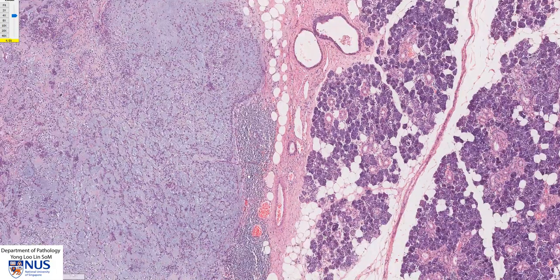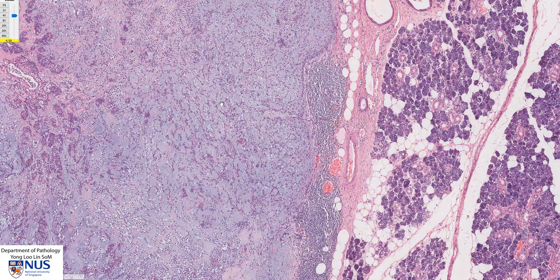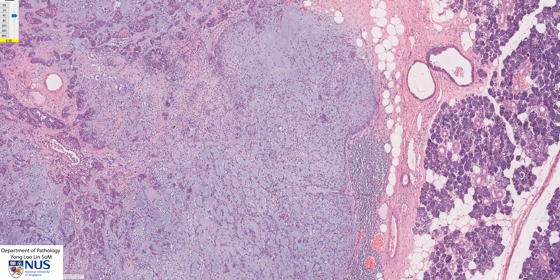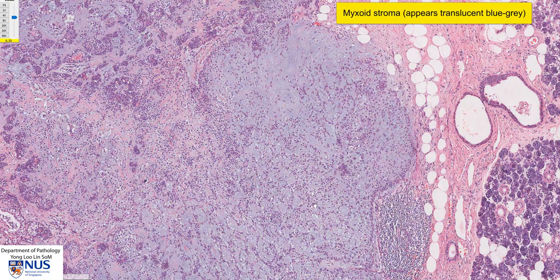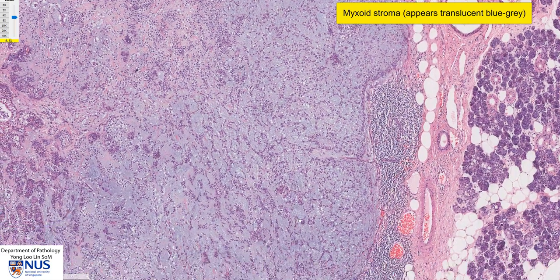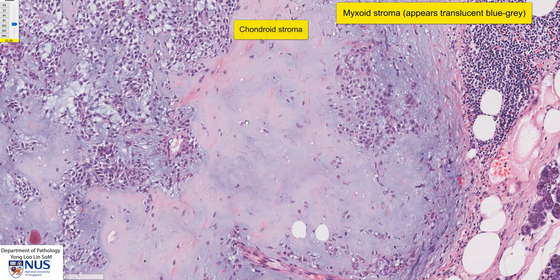Here we have the interface between the normal salivary gland and the tumour. At low magnification, the tumour appears very blue-grey because there is abundant myxoid stroma. When we use the term myxoid in microscopy, we usually mean this kind of translucent bluish-grey appearance, which is due to stromal matrix material or extracellular matrix. In other areas, the stroma has a chondroid appearance, looking like mature cartilage. Putting these together, we call this a chondromyxoid stroma.